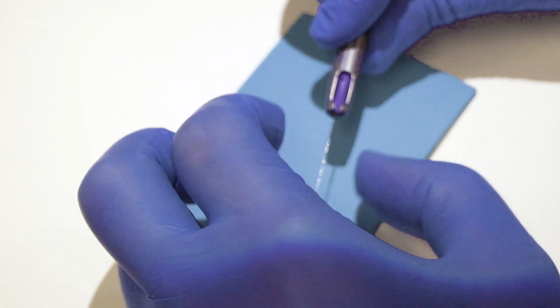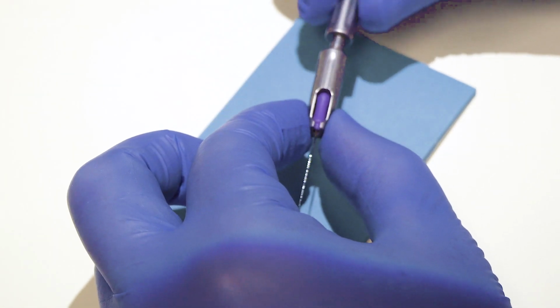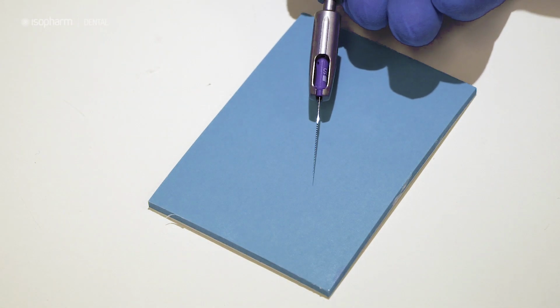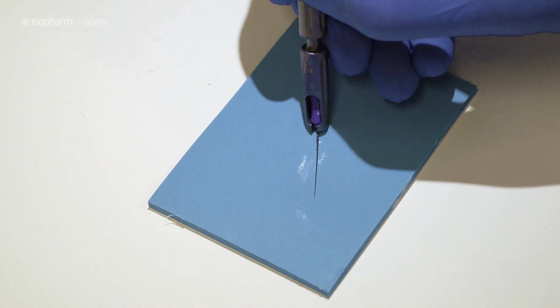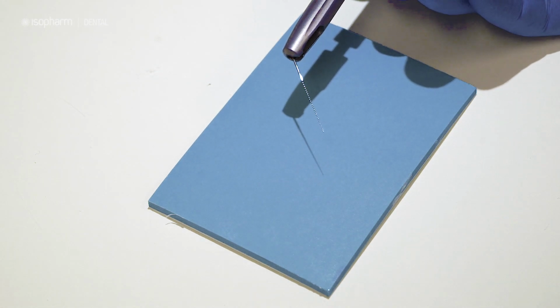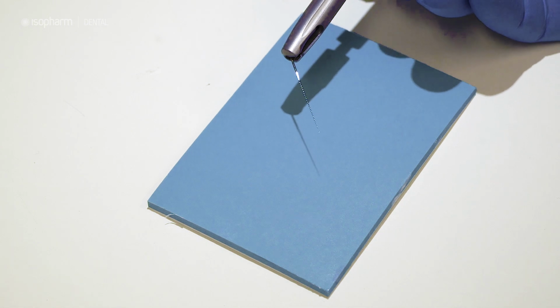Something I've been using for some time now are contra-angled hand files mounted in an endo handle. You can see here on this video that it's very simple to take one of these endo handles, take whatever file you prefer, mount it into the endo handle, and then using something like a mixing pad, just gently bend that file to give you that contra angle that we have with our instruments and we have with our handpieces.